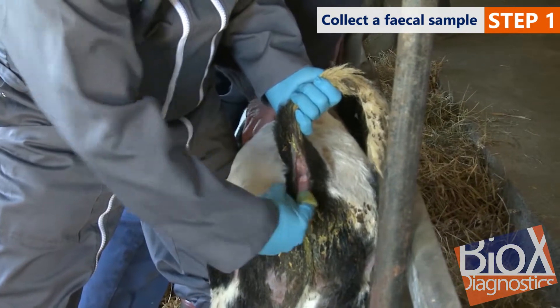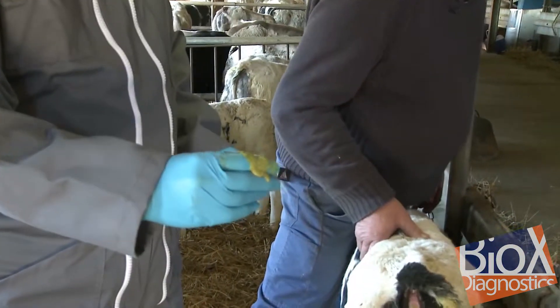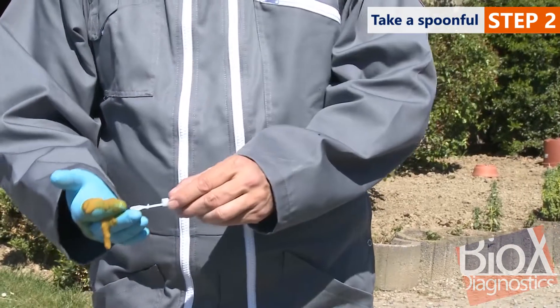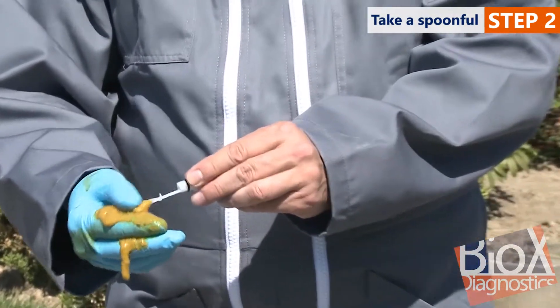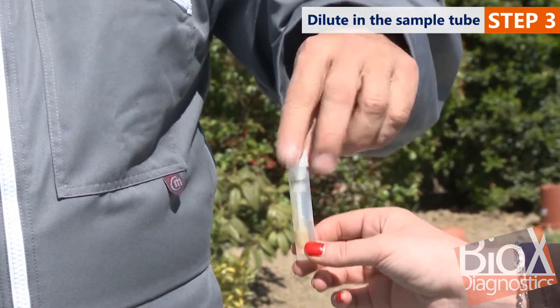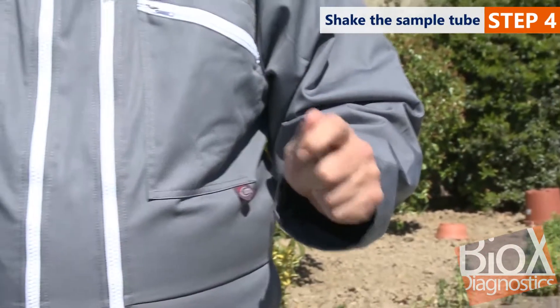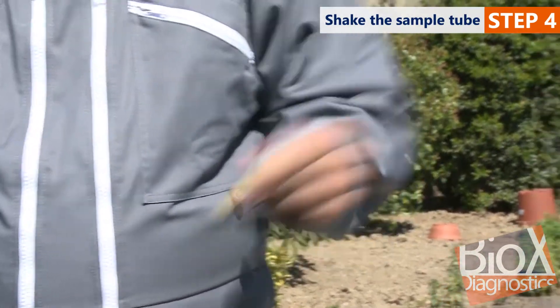Collect a fecal sample, preferably directly from the sick animal's rectum. Fill the specimen tube spoon, then insert the spoon into the tube, screw the cap shut and shake energetically to dissolve the sample in the solution.